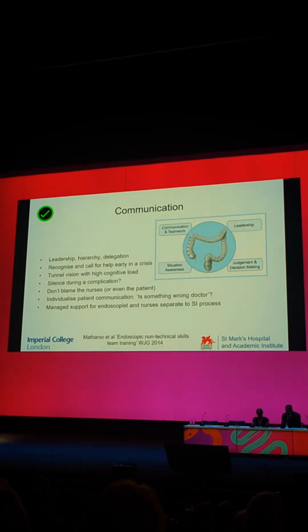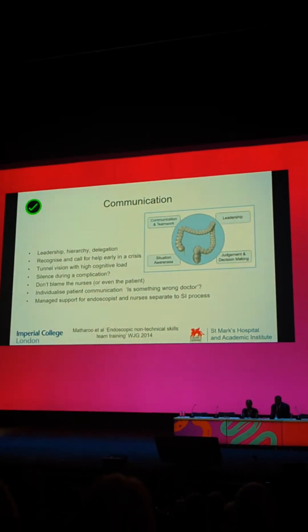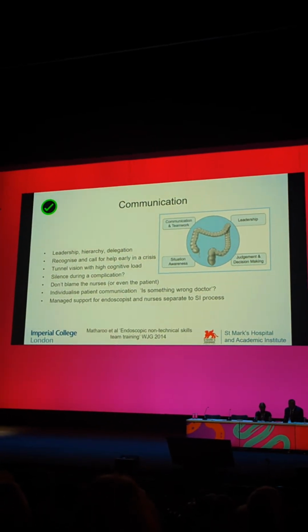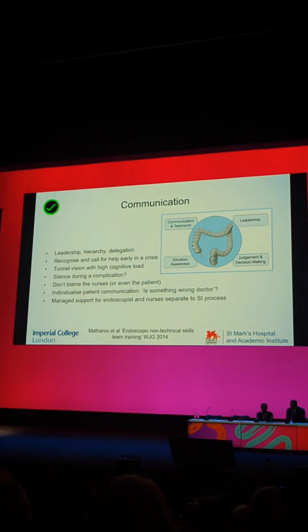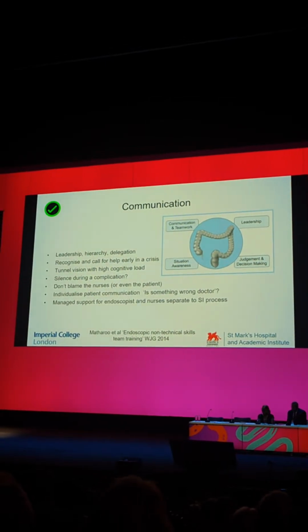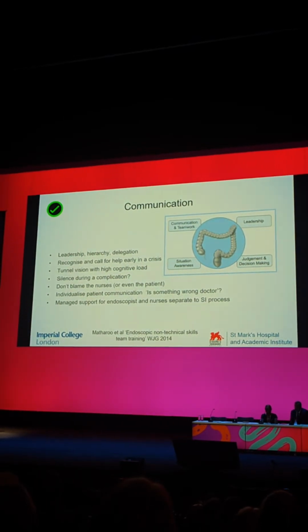Silence during a complication can be tricky. We often all know when the tone of the room changes, something serious has gone on, and the patient is not averse to that either. Many patients may be unsedated or consciously sedated, so you have to think about how you're going to manage the communication to them. You know, yes, there is a bit of bleeding. I'm going to concentrate on this now, but my nursing colleague's going to talk to you about it. And I think individualising patient communication in that scenario is really important, but you may need to delegate that out.